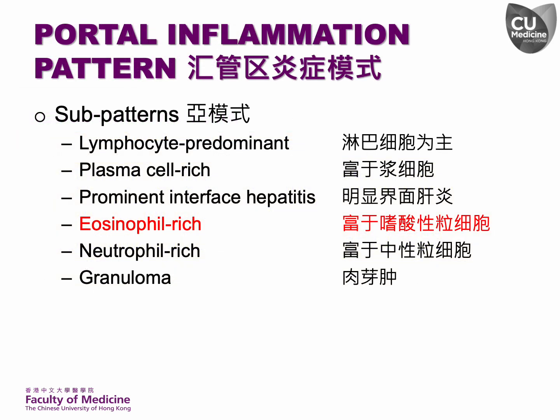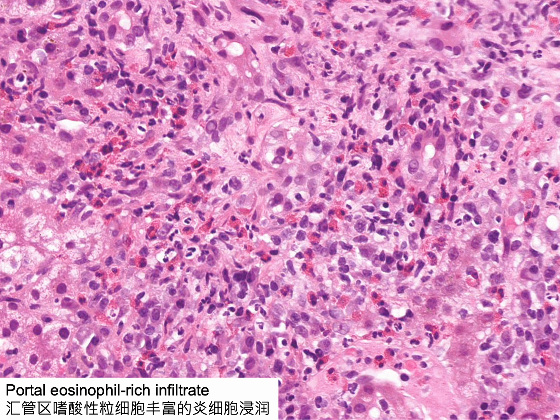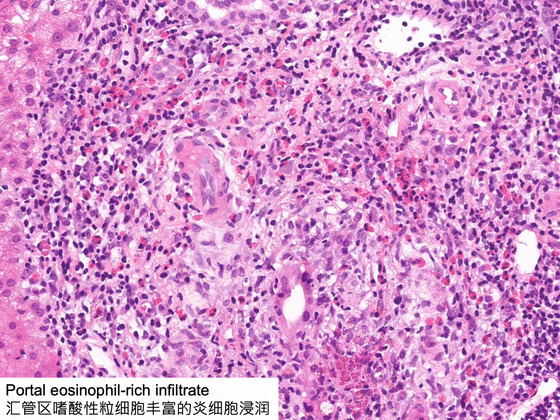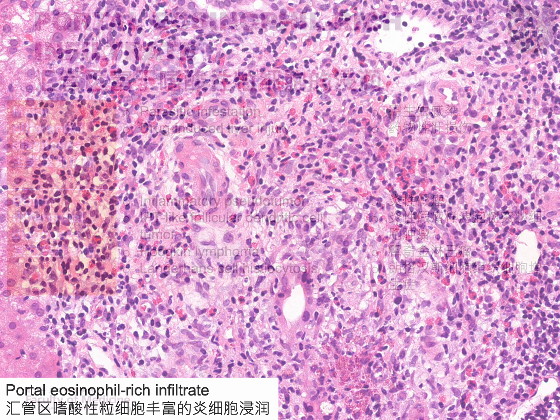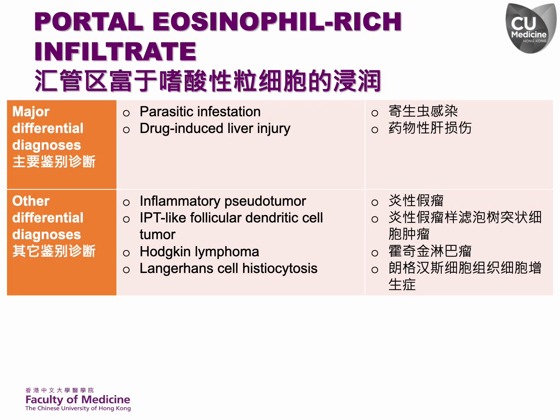Eosinophil-rich inflammation is the next sub-pattern of portal inflammation we're going to discuss. This portal tract is expanded by an inflammatory infiltrate that includes a significant number of eosinophils. Another example highlights a substantial number of eosinophils within the portal inflammatory infiltrate.